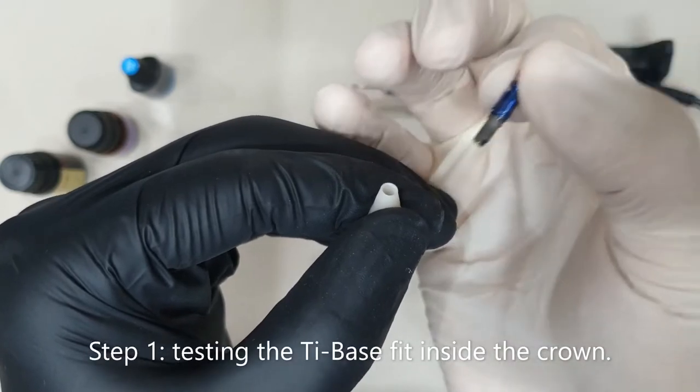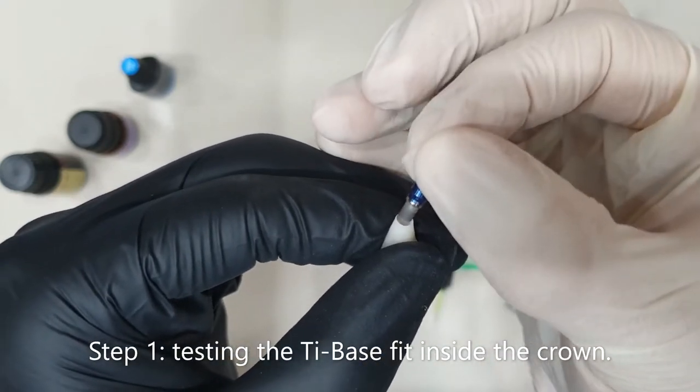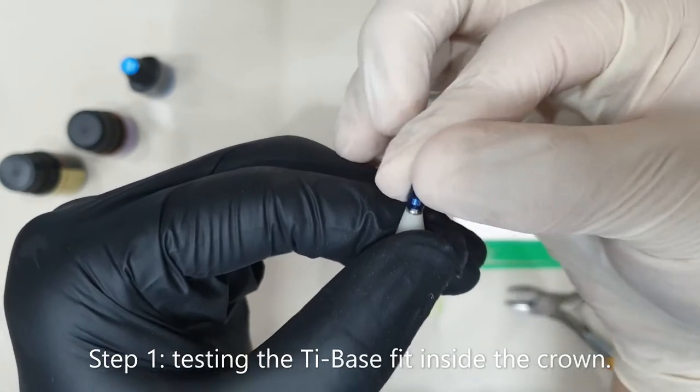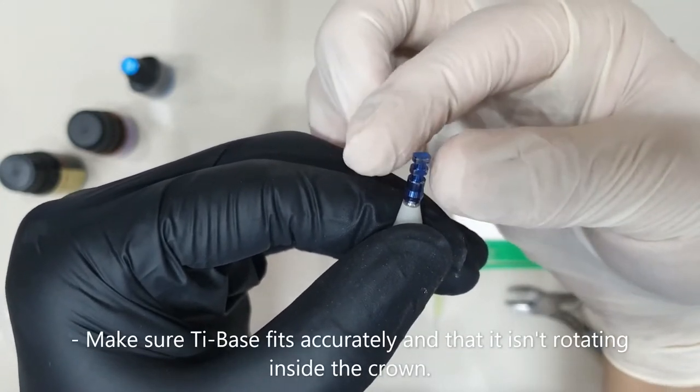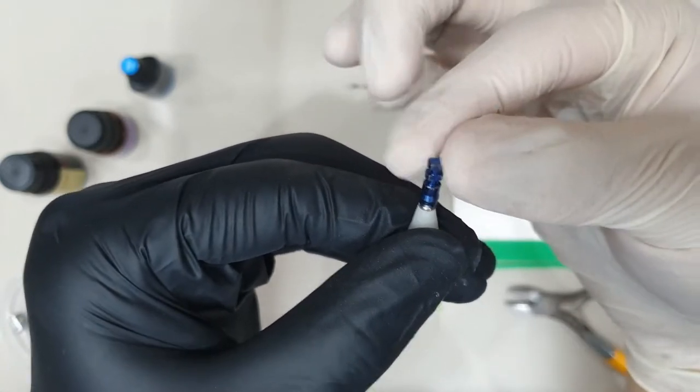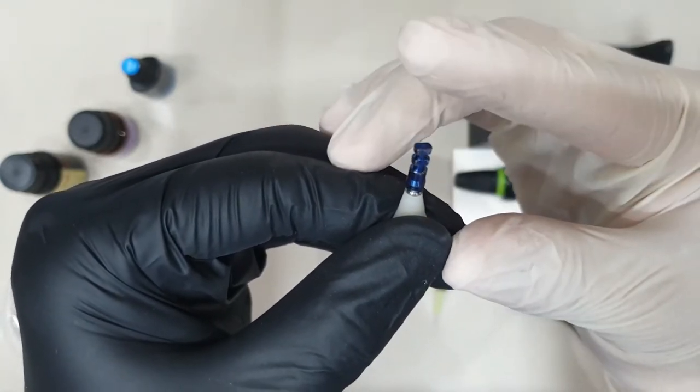I'll start by placing my titanium base inside of my acrylic crown just to make sure that we have a nice and tight fit, and I'll have to make sure that the ti-base does not rotate inside of my crown, like what we have in this case right here.